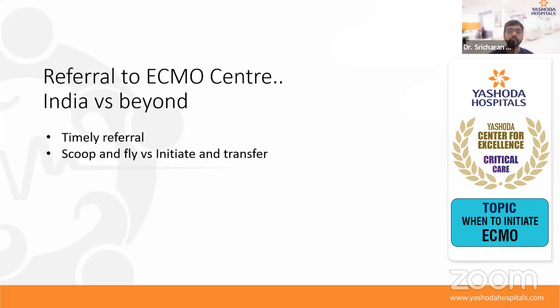So we can either use this scoop and run approach where we go to the center, we assess the patient, we get the patient to our center and initiate ECMO in our center, or we go to the center, initiate ECMO, and then transfer the patient on ECMO, which looks like a much safer option given the availability of infrastructure at this point in time.